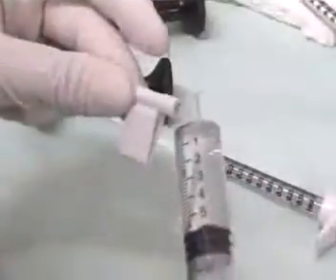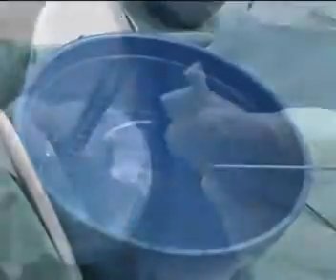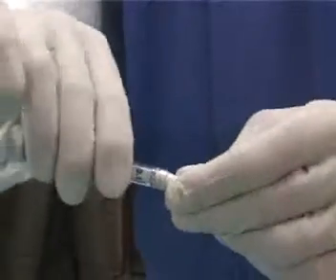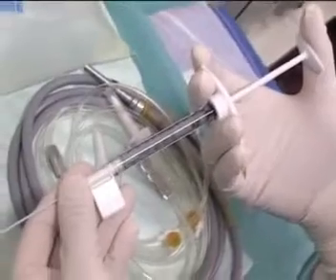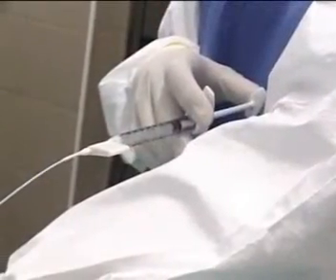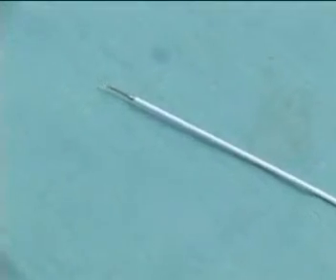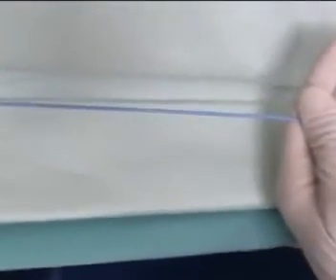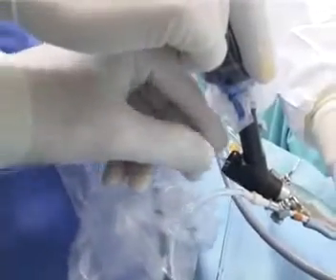It is recommended to flush physiological saline solution through the injection needle. Then, the injection needle should be fastened tightly to the syringe. Before inserting the needle into the working channel of the cystoscope, make sure the injection needle is filled with the appropriate amount of the bulking agent. Due to its high fluidity, Vantris VUR allows a precise injection using a 23 gauge needle, without the need for any additional device.